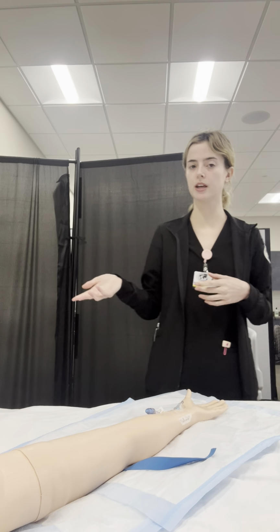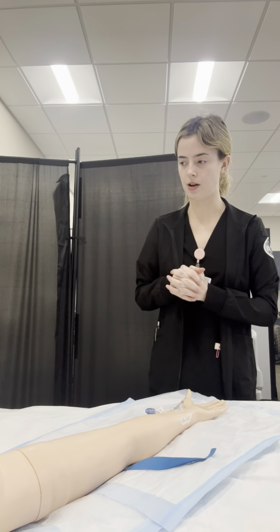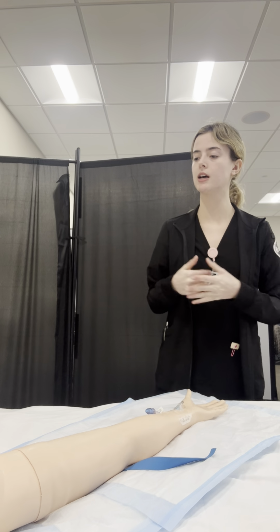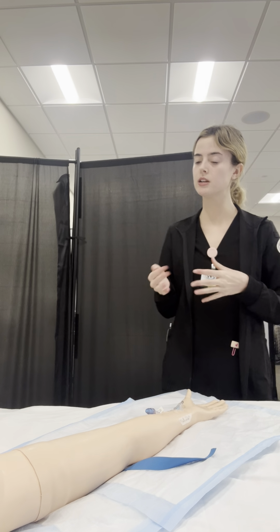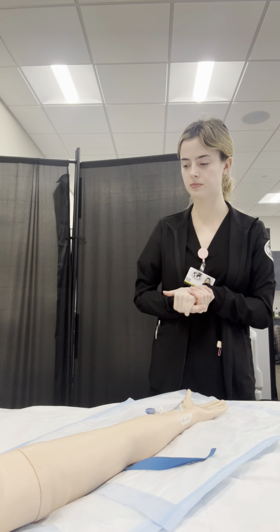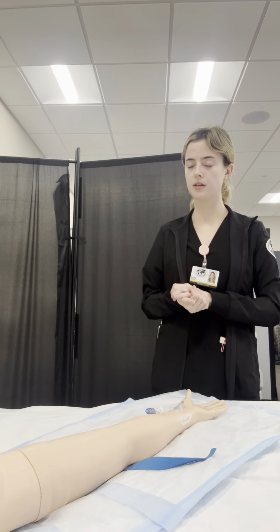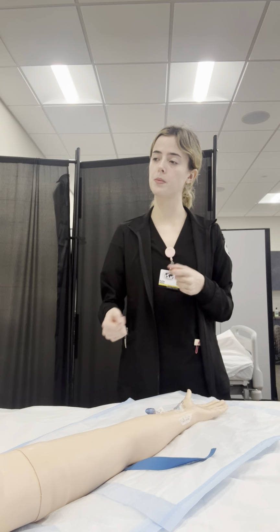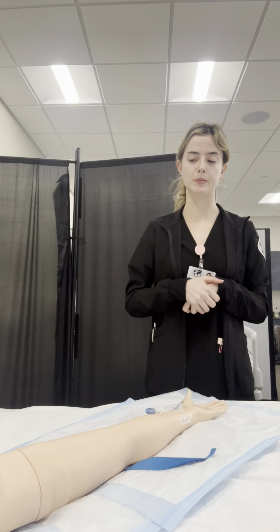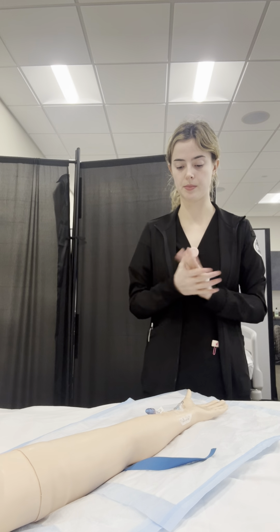I'm going to walk in, provide for privacy, perform hand hygiene, and then I want to introduce myself to the patient. Hi, my name is Kylie. I'm a nursing student. Verify their ID. Can I get your first and last name and date of birth? And do you have any allergies? Okay. And then I'm holding the MAR up against their ID band, making sure that both of those match up. They do. And then I'm going to explain what I'm there to do.